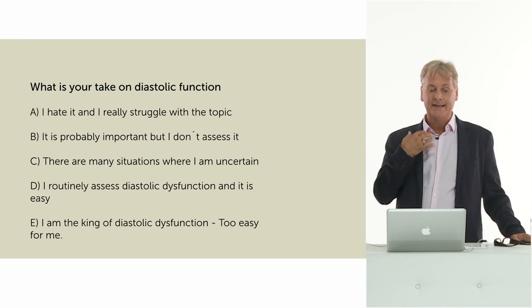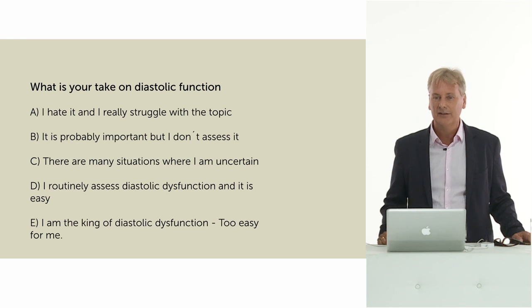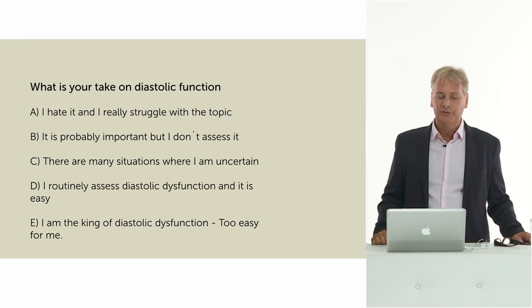But before we do this, we have a question for you. And the question is, what is your take on diastolic function at present? If you could just answer these questions for us, because we have the impression that there are a lot of people who are a little bit confused. To be honest, I'm a little bit confused too. And how would you assess, or how would you look at diastolic dysfunction? Which of these options would you choose?